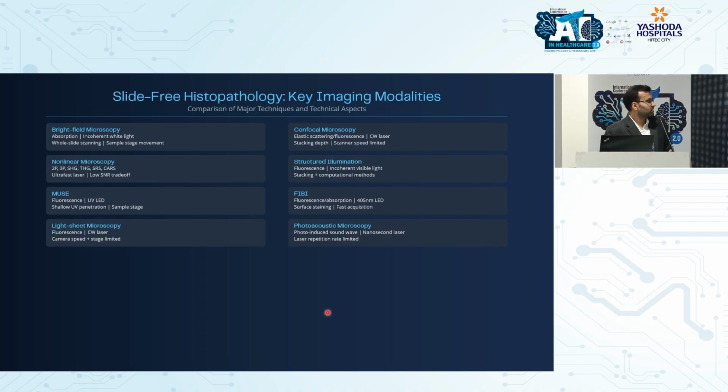New technology, but this is what I could find. I've not gone through each of them. I've explored 1 or 2 options, like I've just read about them. But this is something, if you have a lab where there are regular frozens happening, it can be something which is worth exploring. The technology is out there. We just need to decide if you want to bring it here or not.